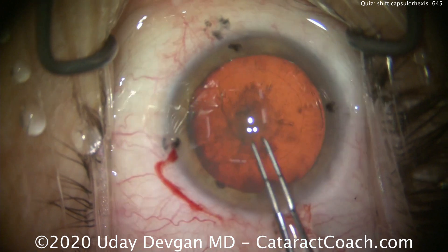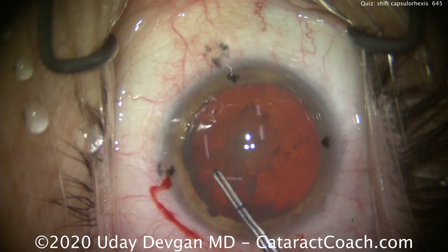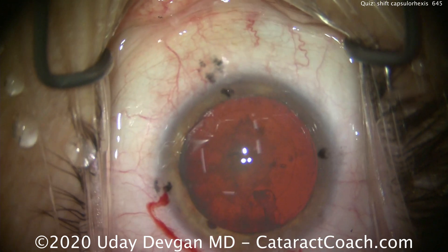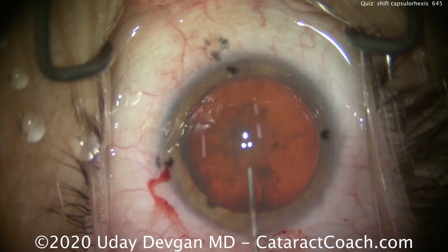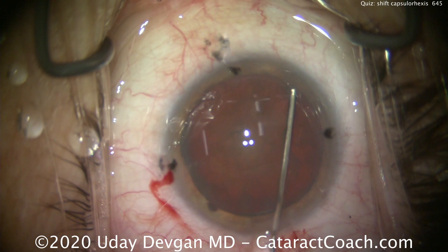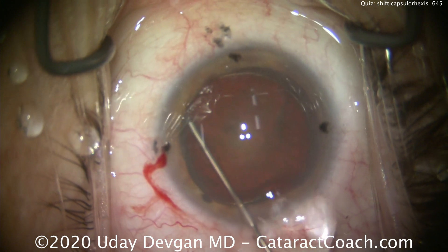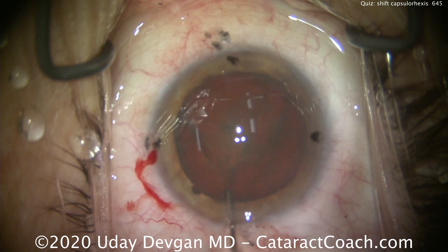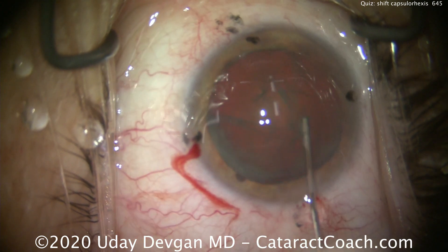And that's the key here — we're not centering the rhexis on the patient's corneal center. It's actually centered on the visual axis. So with that rhexis, it's a 5-millimeter rhexis, and it is beautifully centered. This patient's central visual axis is quite a bit nasally displaced from where you may expect it to be.